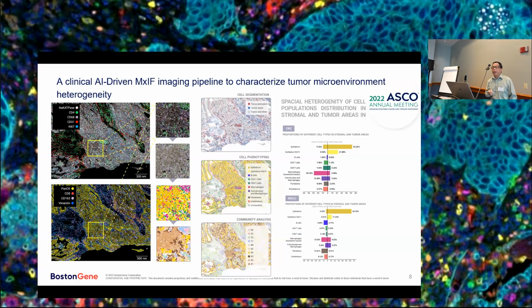So this is actually part of a poster we presented at last year's American Society of Clinical Oncology meeting. As the title states, we have developed a clinical AI-driven MxiF imaging pipeline. This is an automated pipeline to characterize the tumor microenvironment. I will not go into more detail, so if you are interested, you can contact me later. We can give you the full poster in which we have the whole process for validation of this method and its applications in several tumor types.